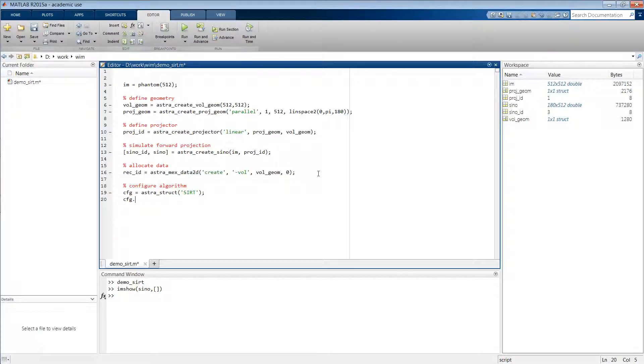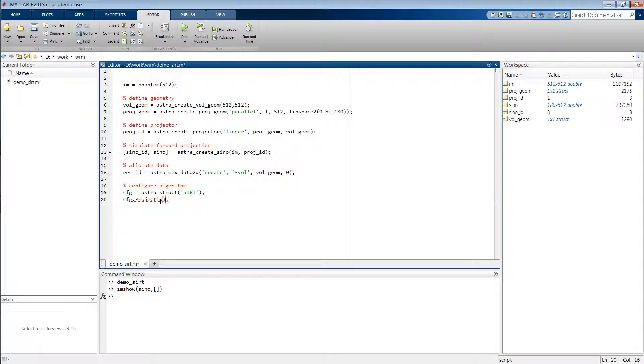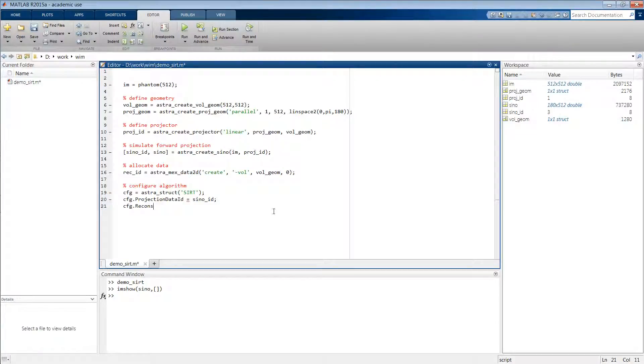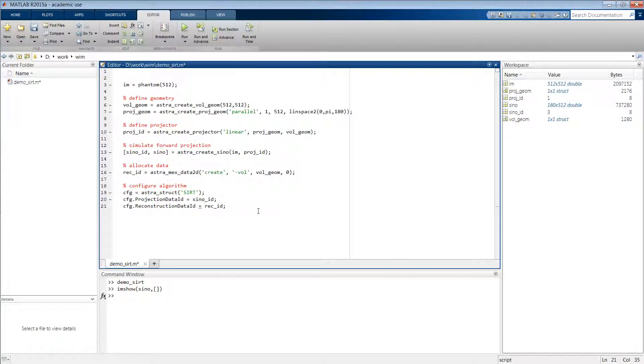The first of which is to link the algorithm to our projection data. So we then type ProjectionDataId equals the identifier of our sinogram, and then also ReconstructionDataId, which is the identifier of our allocated volume.